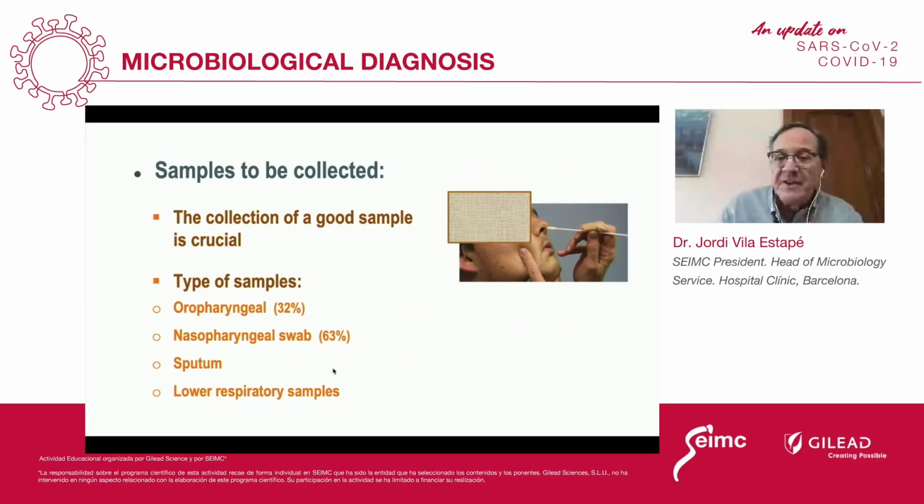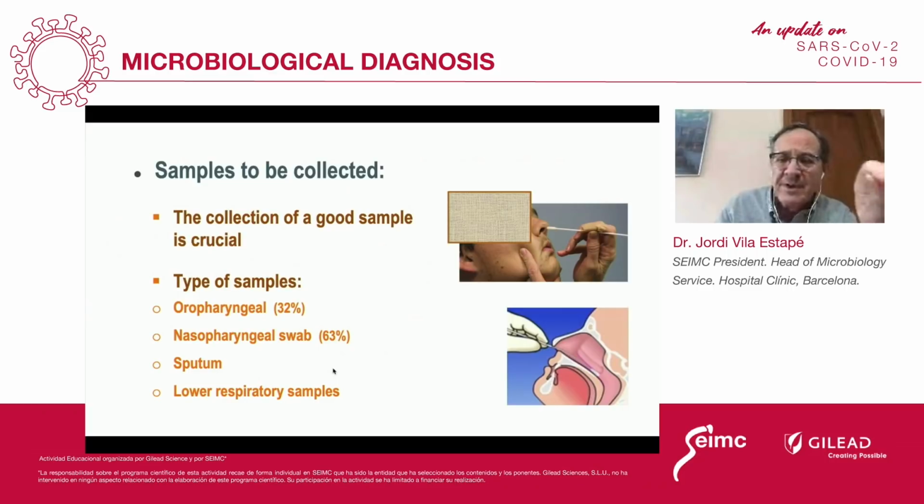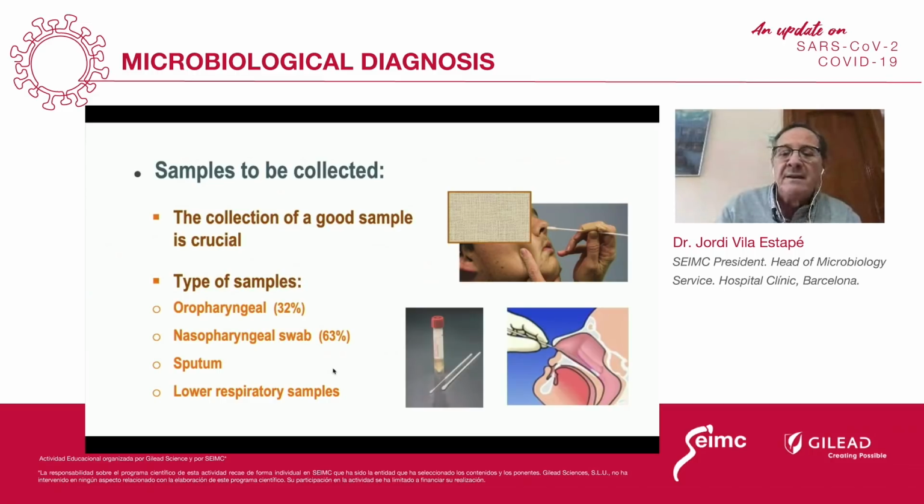As you can see in this figure, this is the way you can collect the nasopharyngeal swab, just rotating the swab inside the nasal tract. Then the swab is inoculated in a liquid media, either transport or inactivating media. I will discuss this modification, either transport or inactivating buffer.